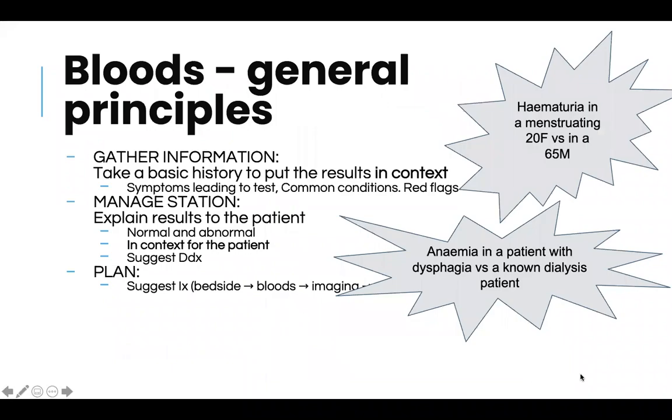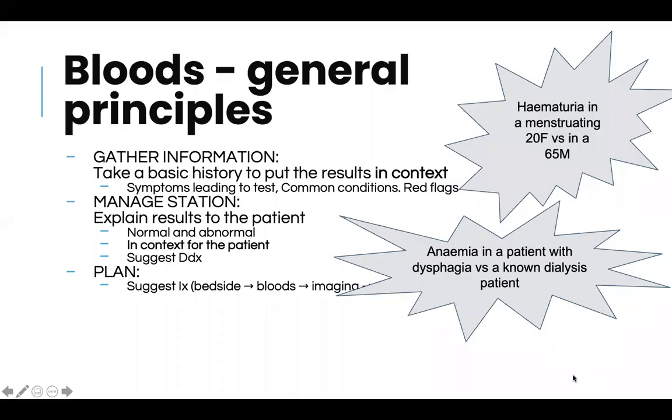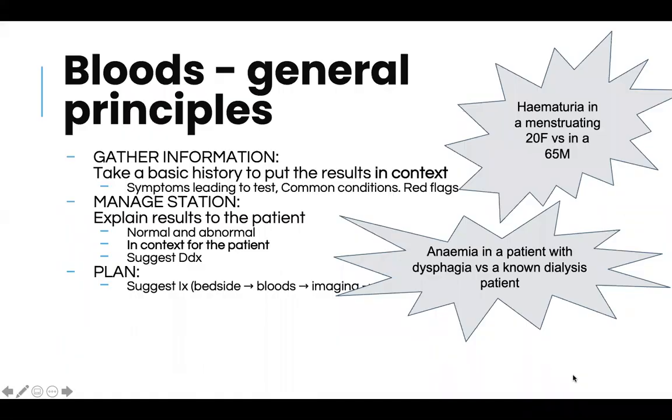So, general principles that I like to keep to. The first bit is gathering the information. Just go back and gather the information. So as you said, symptoms leading to the test, common conditions, red flags.